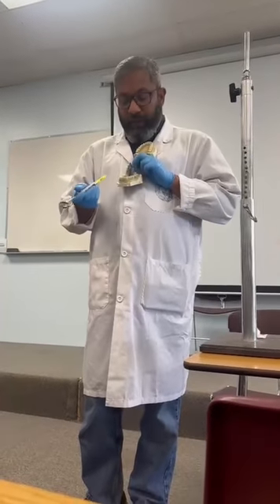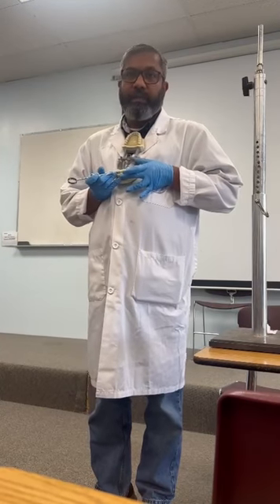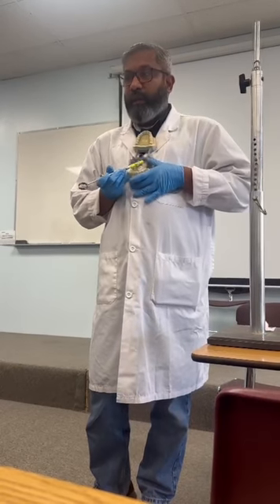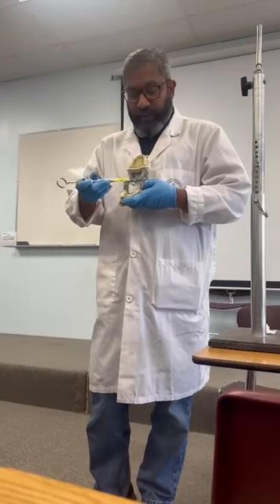Up to the middle? One side? All the way to the middle. So if I give the injection here, it ultimately blocks all the tooth nerve stimulation, because there is only one nerve here. This is easy. Okay, so for inferior alveolar nerve block, we are giving the injection here.